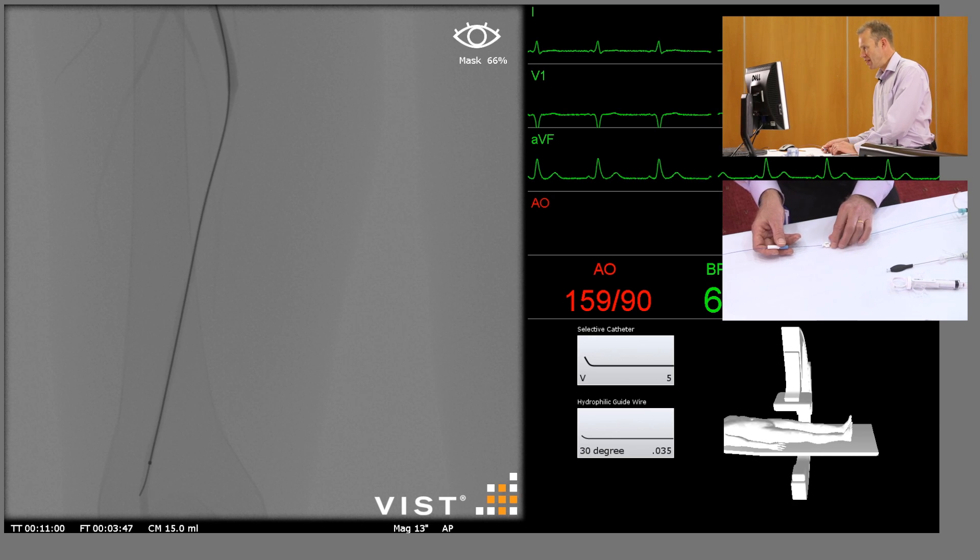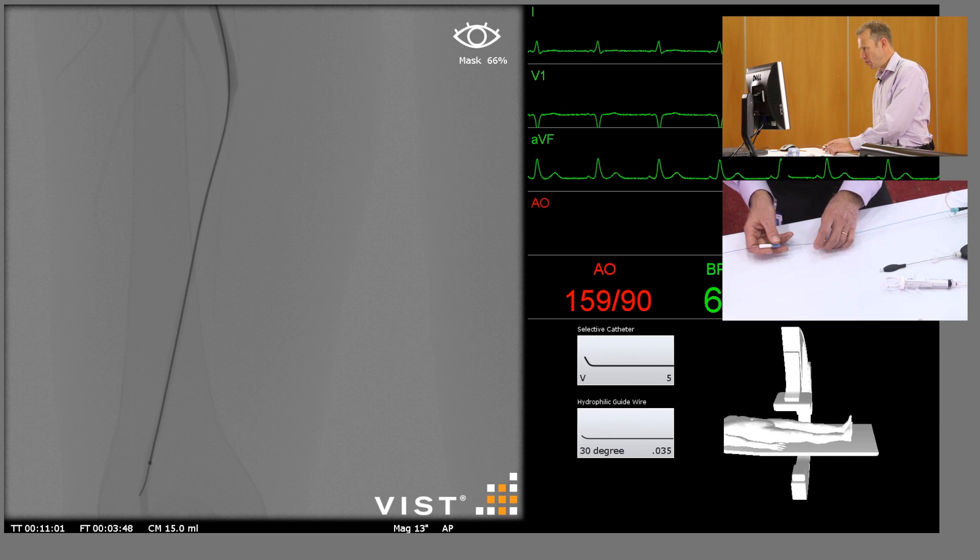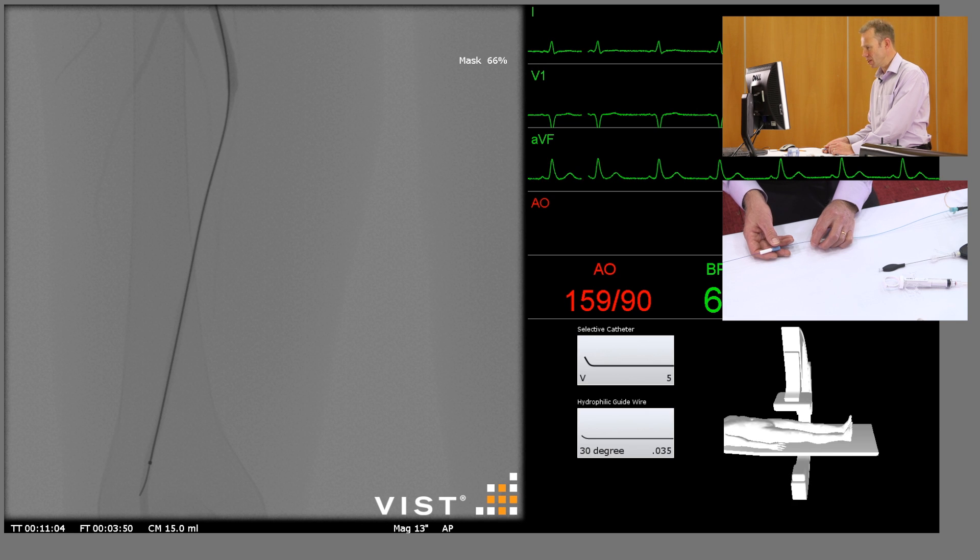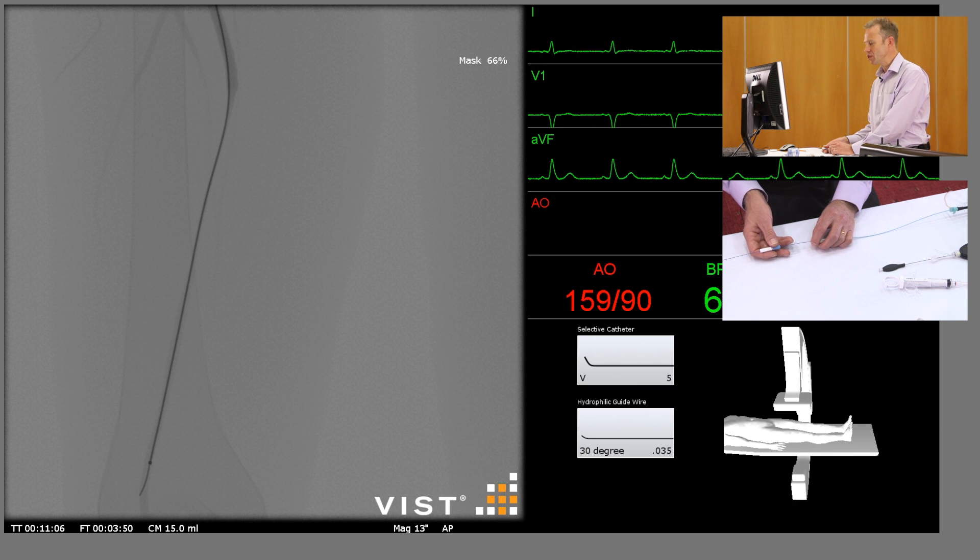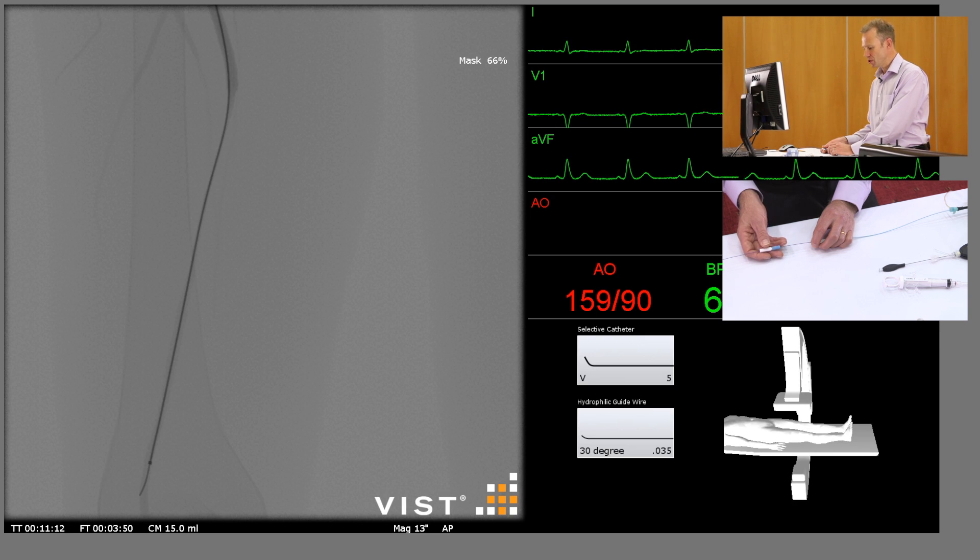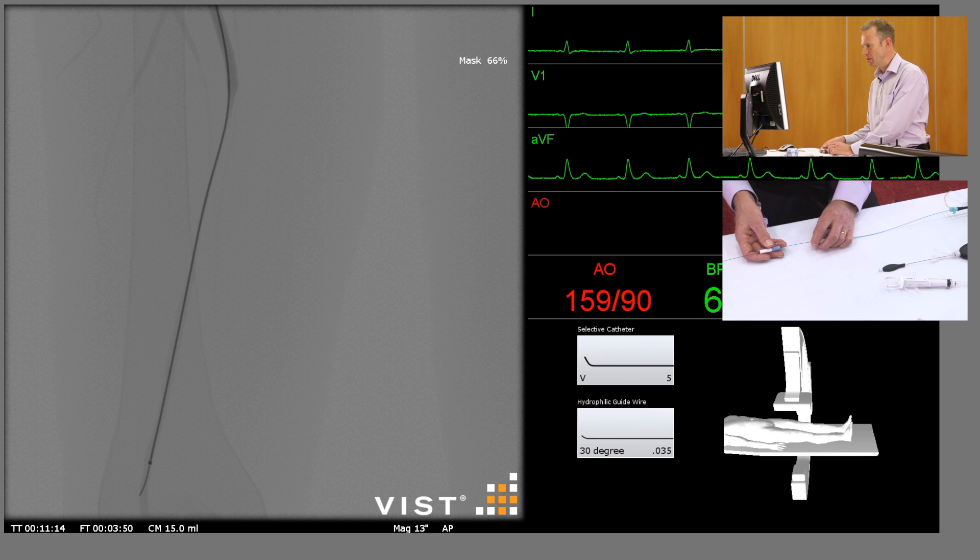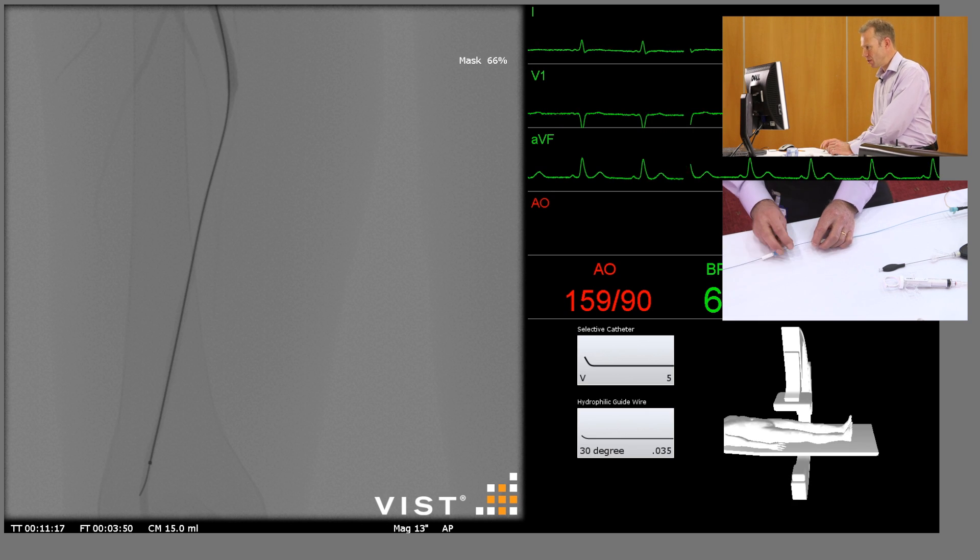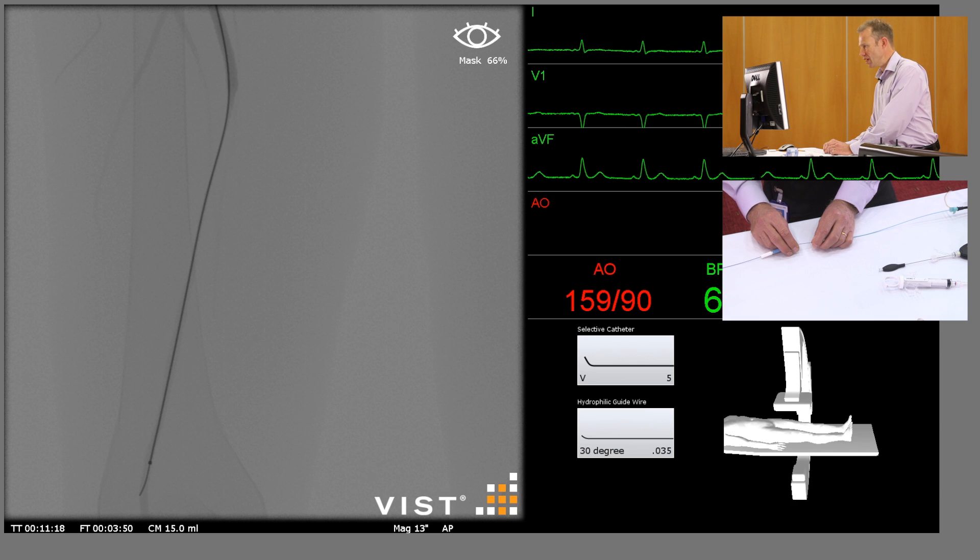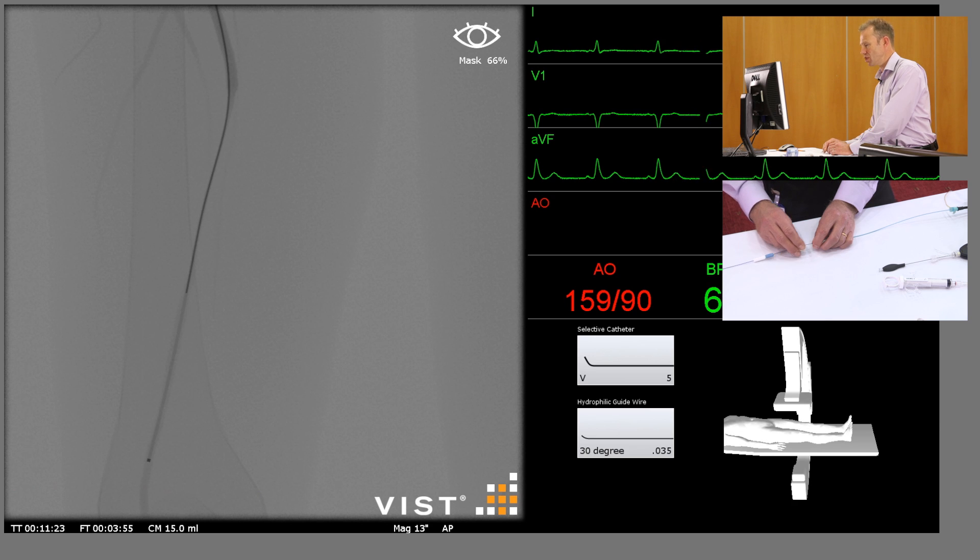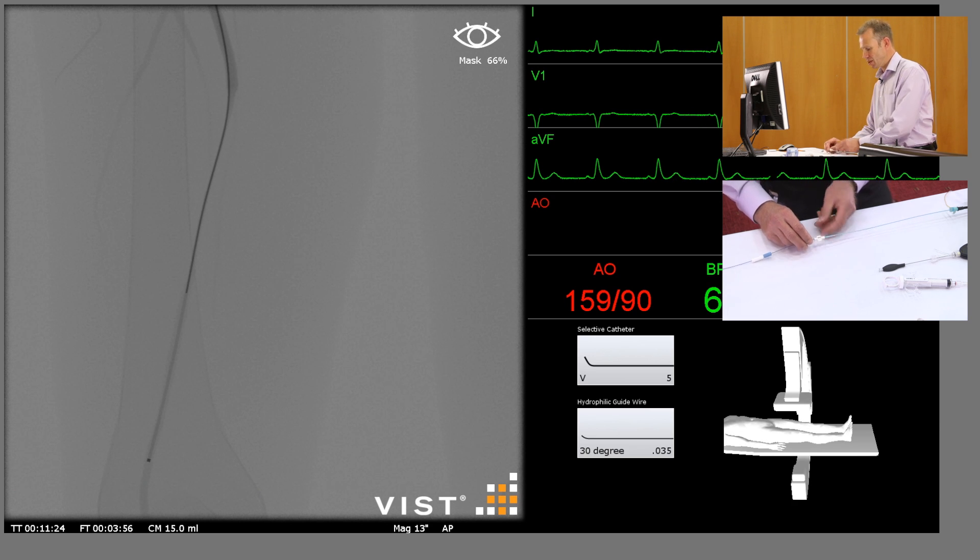Now if we're going to stent this lesion we need to know exactly how long the lesion is. There's several ways you can measure this. You can measure it by calibrating on your screen, or you can do what's called the guide wire pullback technique, and that's what I'm going to show you. So I'm going to pull the guide wire inside the catheter back to the start, or actually the distal end of the stenosis, which is about there.